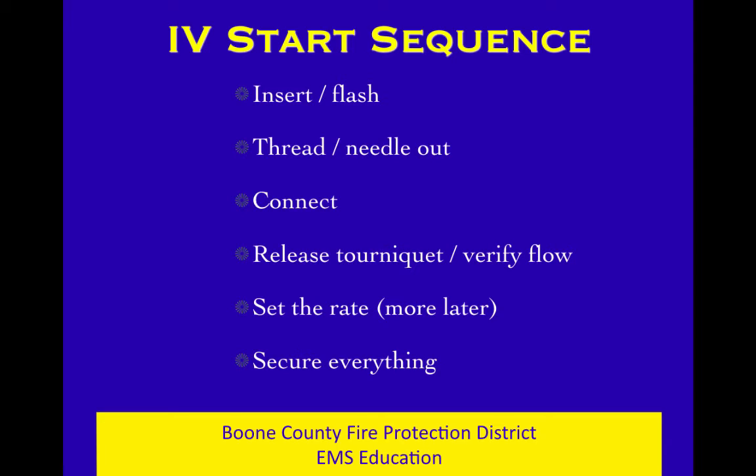And it'll happen to you in simulation lab. It'll happen to you for real, possibly. Hopefully we'll get this worked out of you in sim lab. But you start the IV and you don't release the tourniquet, and then the IV doesn't flow, and you spend a bunch of time messing around with the IV trying to get it to flow when all you had to do was release the tourniquet. So that release the tourniquet's a key step, and that's where this work on sequence makes a huge difference.